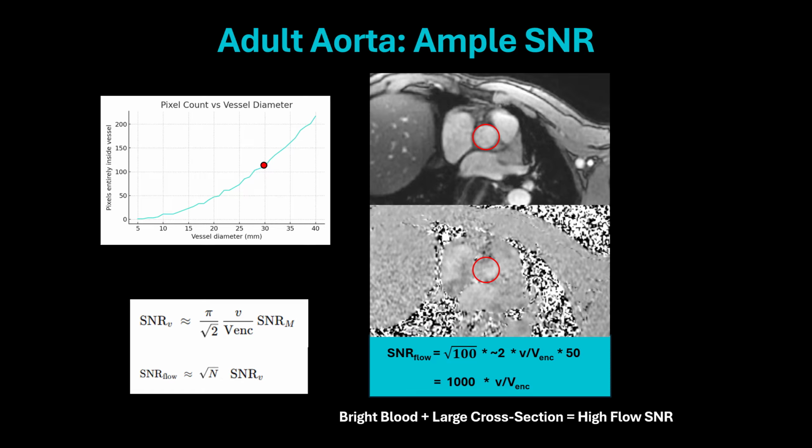But is there a downside to setting the Venc too low? Yes. And it can make your flow values less accurate. That's exactly what we'll cover in the last episode.